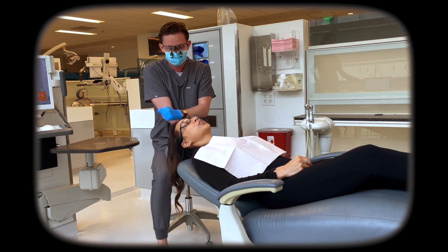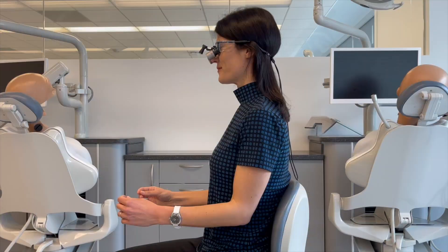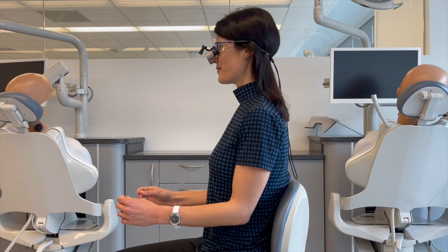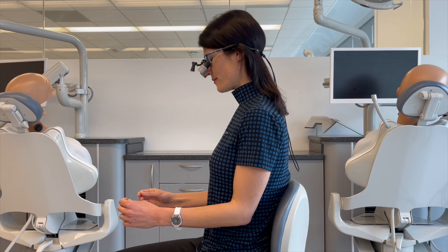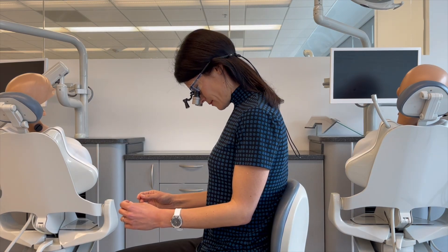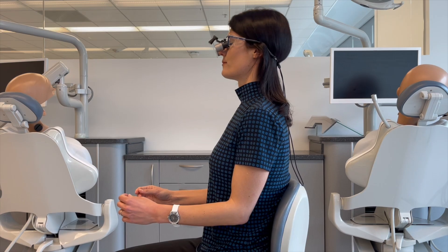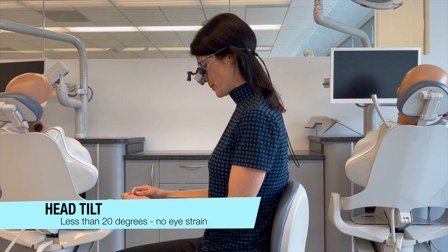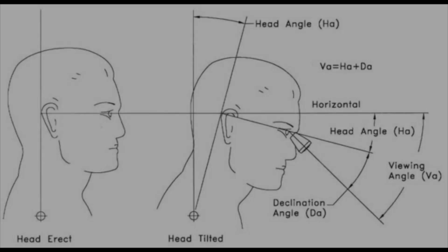First thing to know is how important it is to be aware of your head tilt and natural neck position. We don't want your chin to be too far into your chest or your neck extended too far backwards. We want you in a nice comfortable position with a head tilt angle less than 20 degrees without any eye strain.